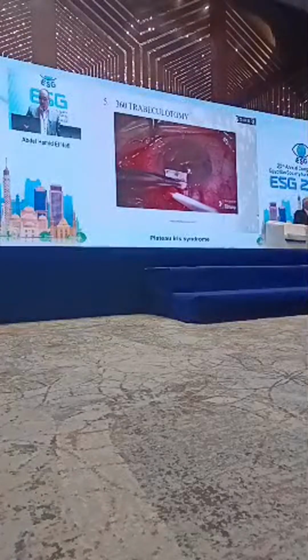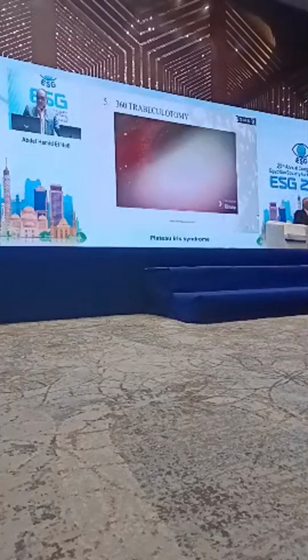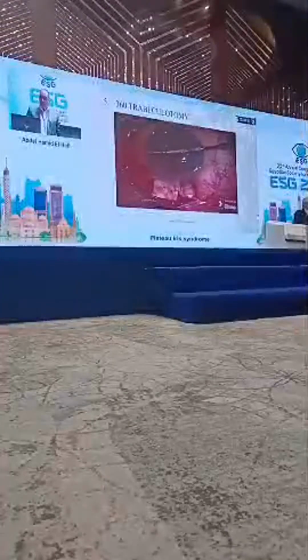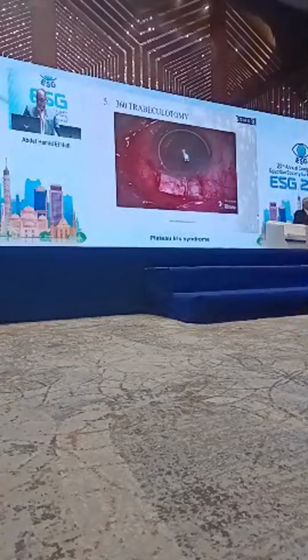Maintaining the trabeculodescemetic membrane ensures not converting the procedure to a penetrating procedure. And this is how the part of the trabecular meshwork, which was excisionally removed, came out.